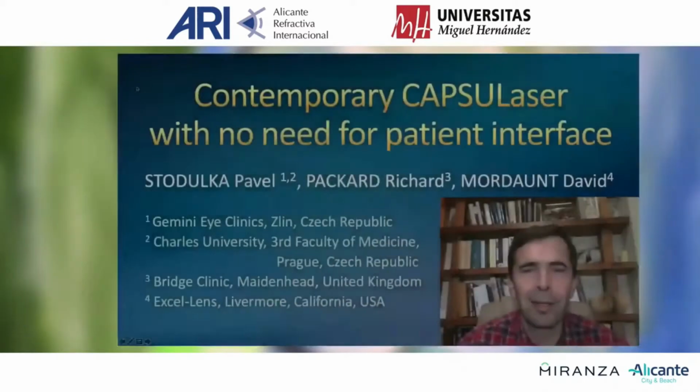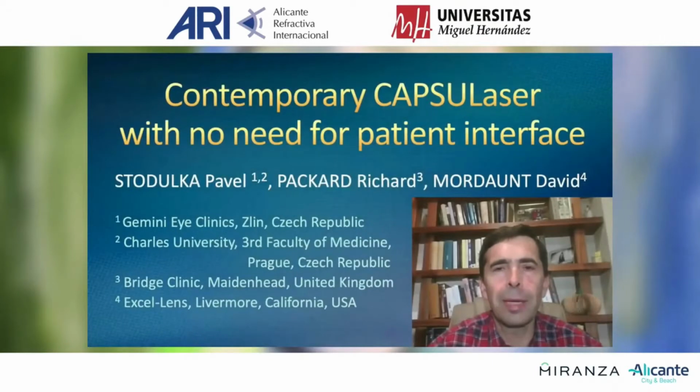Now we're ready for another video, which is from Pavel Stodulka about CAPSULaser with no need for patient interface and new centration feature. He will show to us his practice, his experience. He's the one that has made more cases worldwide, and indeed I thank Pavel to be here today in this special Saturday session of CAPSULaser. Please run the video of Dr. Stodulka. This presentation is going to be about contemporary CAPSULaser with no need for patient interface and the recent advances on CAPSULaser capsulotomy.